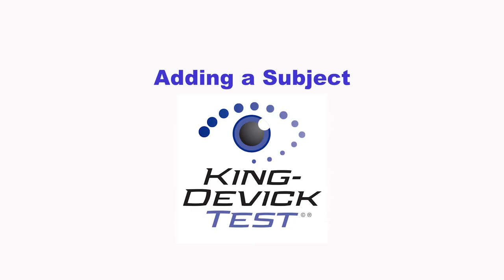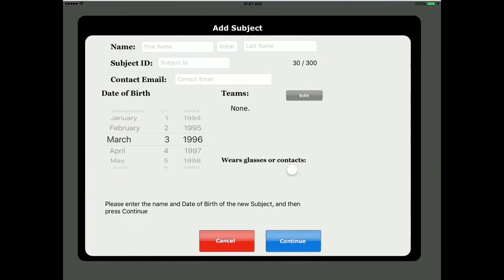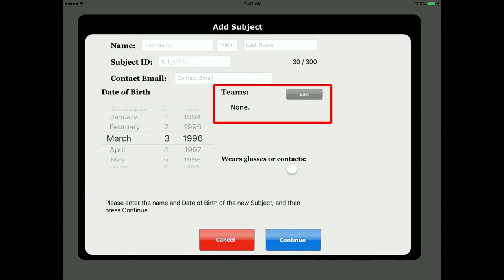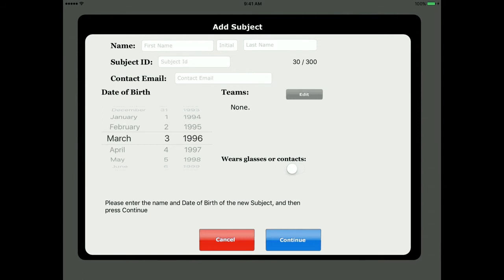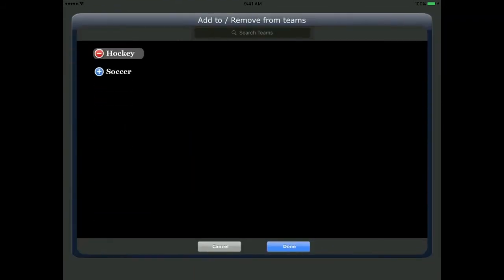Adding a subject: Add a new subject by tapping Add Subject. Enter the subject's first name, last name, ID, date of birth, and mark whether or not the subject wears glasses or contacts. Tap Edit to assign the new subject to a specific team. Tap the plus for the team you would like to add the subject to, then tap Done when complete.